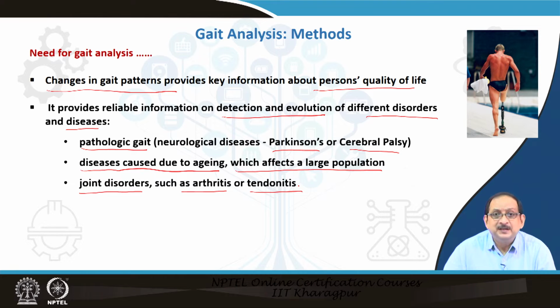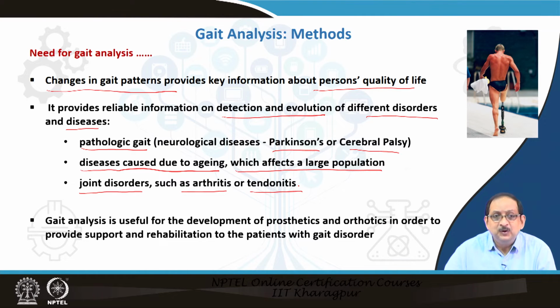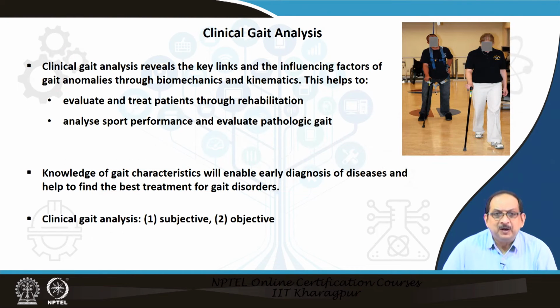Observation of these gaits is an important aspect of diagnosis that may provide information about several musculoskeletal and neurological problems. Gait analysis is useful for the development of prosthetics and orthotics in order to provide support and rehabilitation to the patients with gait disorders. Let us discuss clinical gait analysis.